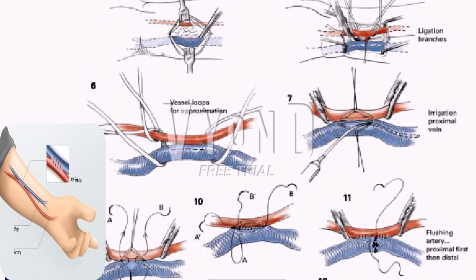The patient is administered intravenous heparin. Fine curved or straight bulldog clamps are placed proximally and distally on the radial artery. A longitudinal arteriotomy of 1 cm is made. In some cases the artery may be heavily calcified and it will be necessary to probe the artery proximally to ensure patency. Once patency is established, the proximal bulldog clamp is reapplied. The artery and vein are aligned side to side, and anastomosis is created using running 6-0 non-absorbable monofilament sutures. The needle on the arterial side must be passed from the endothelial surface outward, ensuring the endothelium is tacked down.